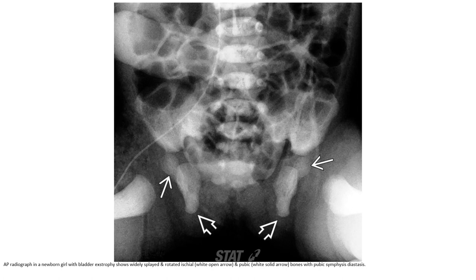AP radiograph in a newborn girl with bladder exstrophy shows widely splayed and rotated ischial bones and pubic bones with pubic symphysis diastasis.